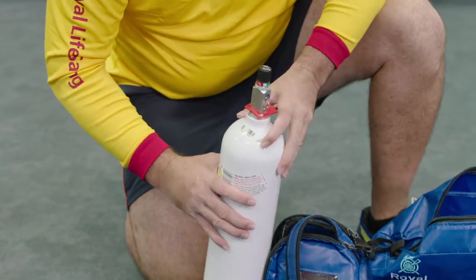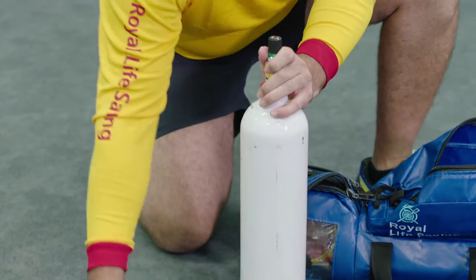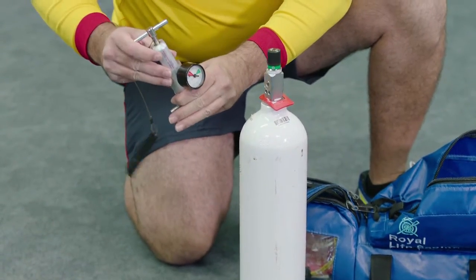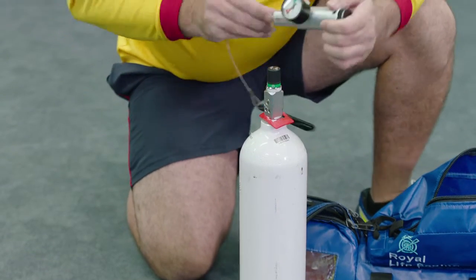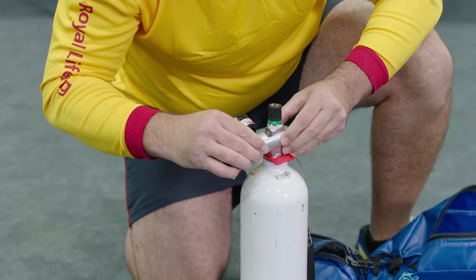Cylinders should be cracked before attaching the regulator. Ensure the cylinder is pointing away from people when it is being cracked. Check the regulator has a bodok seal. Line up the pins on the regulator with the respective holes on the cylinder.